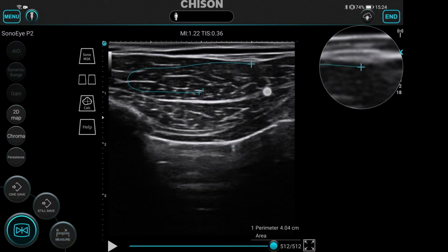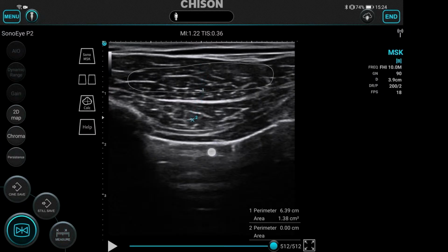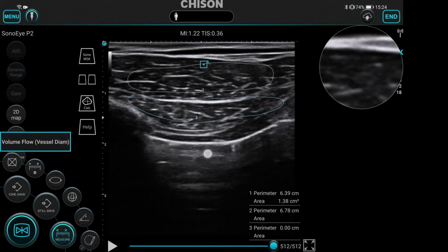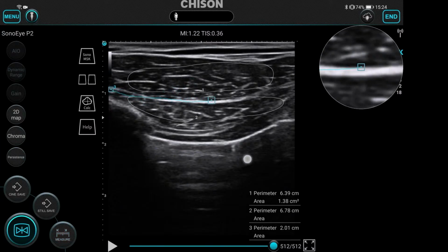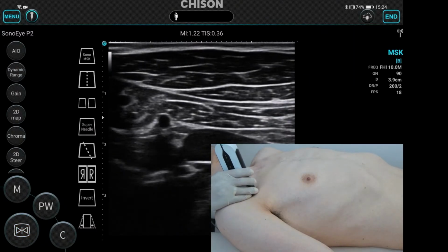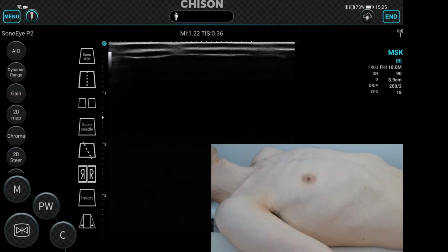this one big is the pectoralis major muscle, okay, and then we have this one is the pectoralis minor muscle, and this white bright line which you see in between, okay, this line which is going is the interfascial plane. So PEC 1 is a hydrodissection of interfascial plane between PEC major and PEC minor. So now let's start scanning again.